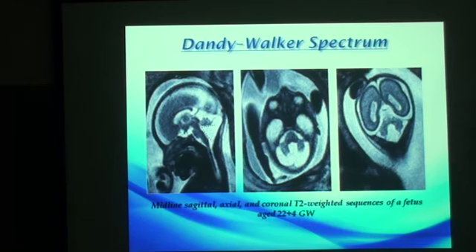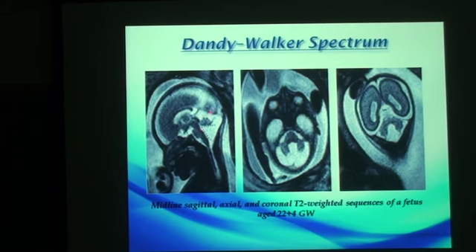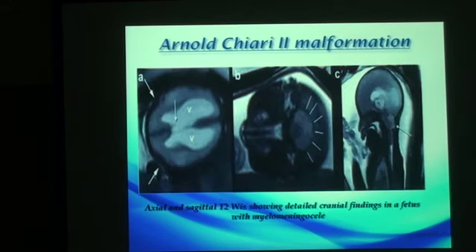The Dandy-Walker spectrum can be easily diagnosed by a triad: first, aplasia or hypoplasia of the vermis; second, a cystically dilated fourth ventricle and its connection to the cisterna magna giving a keyhole appearance; and third, hydrocephalus. In addition, the tentorium is in a higher position than normal.